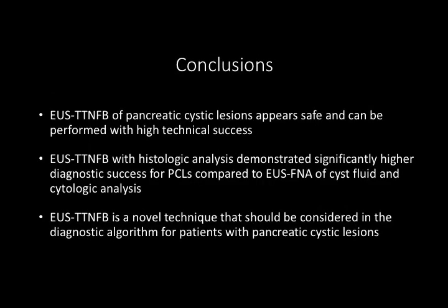In conclusion, EUS through-the-needle forceps biopsy technique of pancreatic cystic lesions appears to be safe and can be performed with high technical success. This technique should be considered in the diagnostic algorithm for patients with pancreatic cystic lesions.